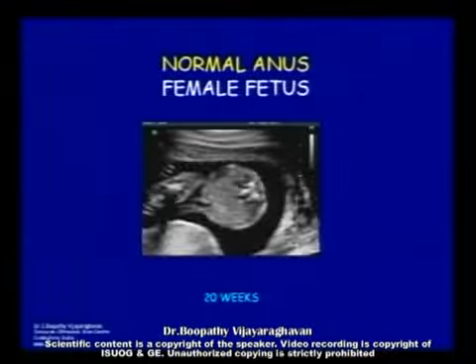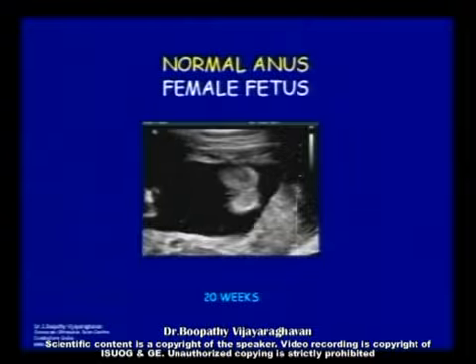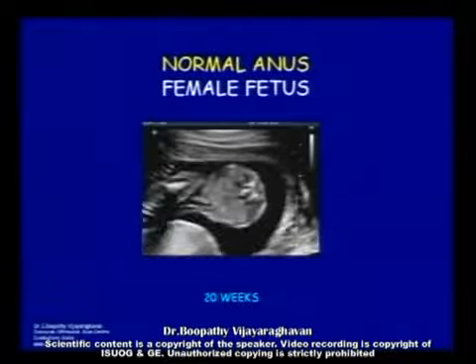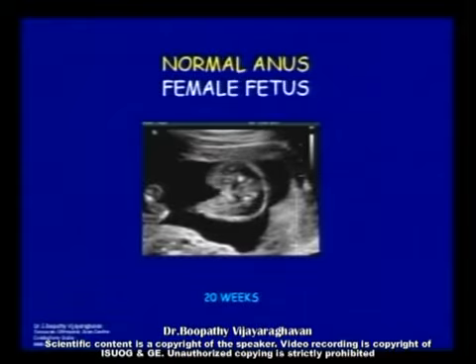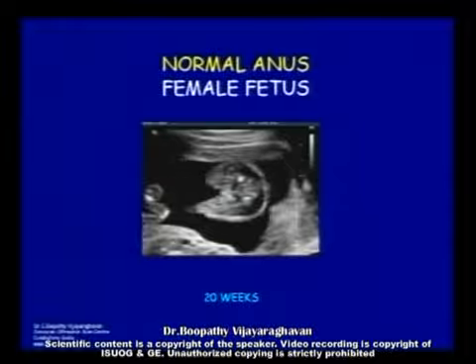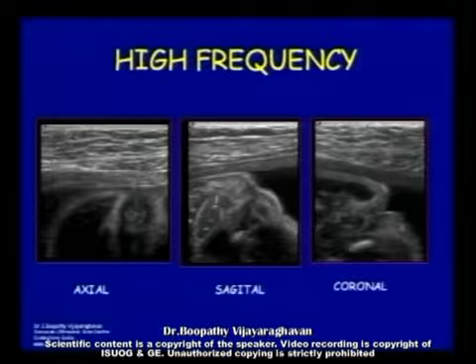And finally, I am showing you a very simple technique. You have been listening to very complicated ultrasound techniques from the morning. So for a change, this is a very simple technique, nothing more, no extra time involved. It is part of your routine examination. You see the external genitalia. With a slight modification, you see the bottom well and you see the anus nicely.